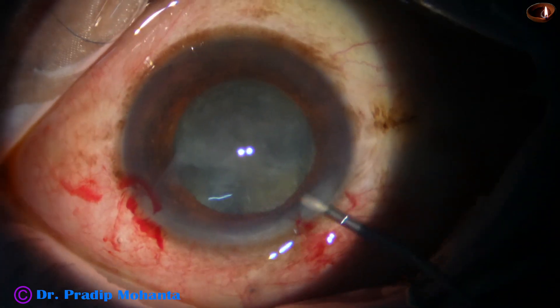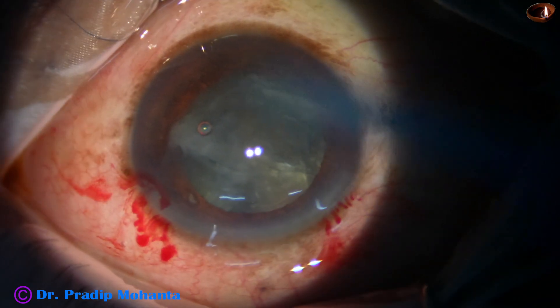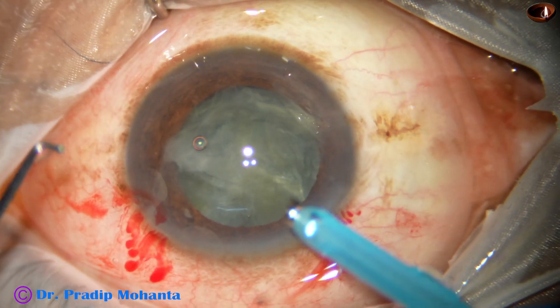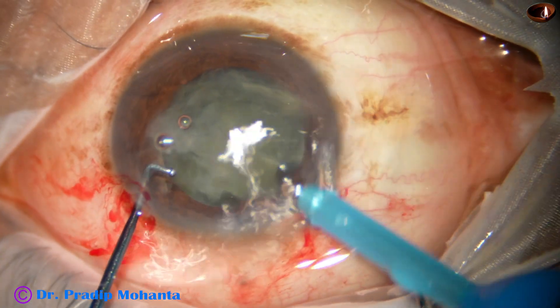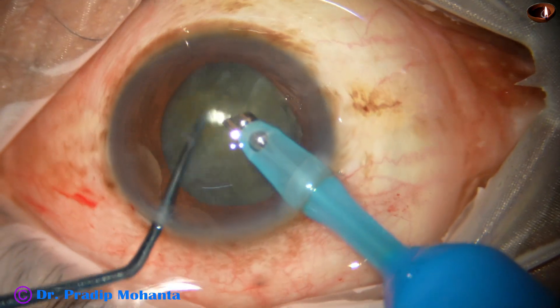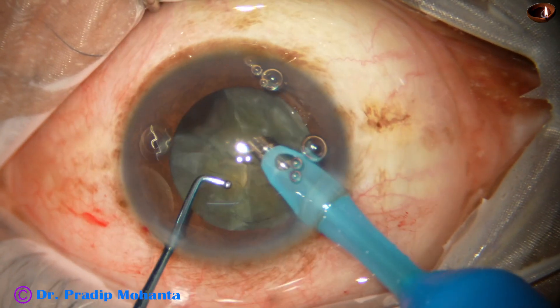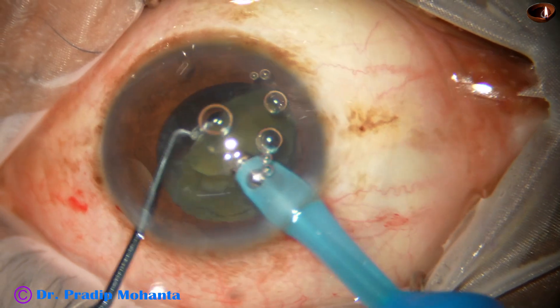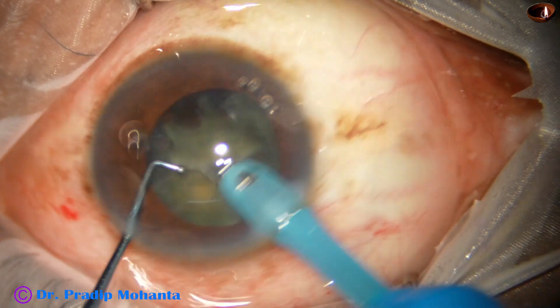We have got 4 pieces out of this soft nucleus. Visco has been again injected and here goes the phaco handpiece with its bevel down. Some superficial lens matter is removed and then one piece is picked up and emulsification is started.